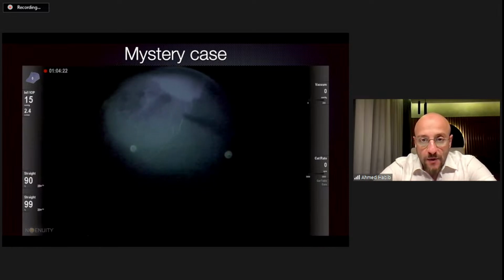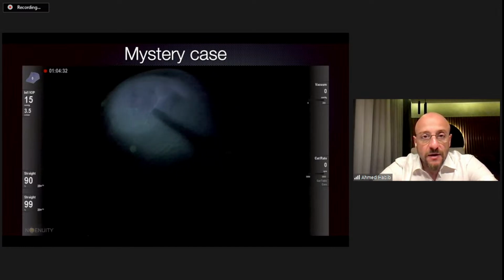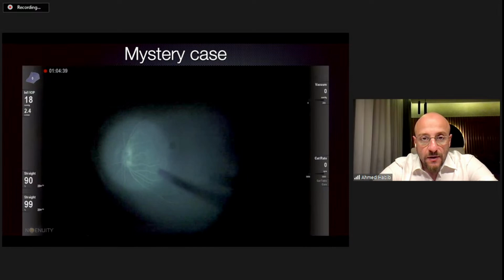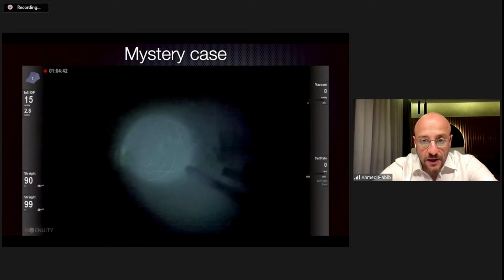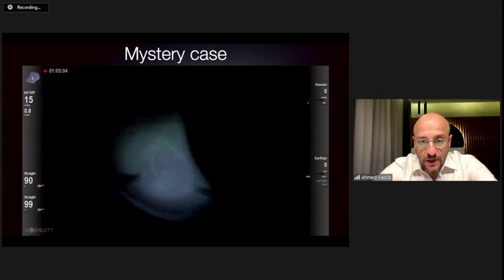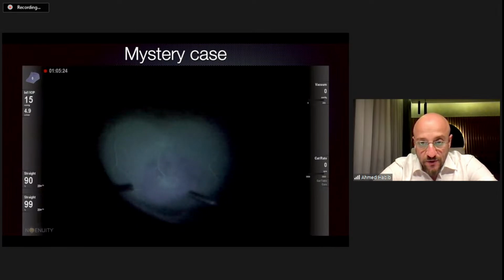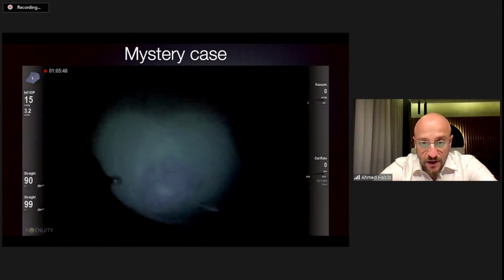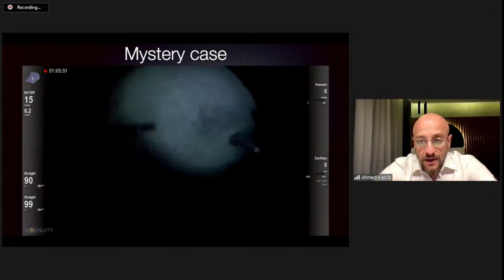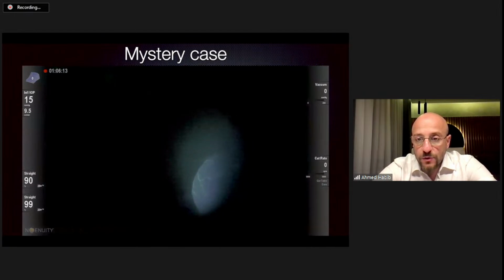We were thinking about the cause, and so we waited for the late phase. Here I'm just checking the areas where the vasculature stops, and as you can see, there is leakage in the macula and leakage on the disc, and here coming for the late phase. And as you can see, if I want to see something better, I approximate the light and the fluorescein, and the fluorescence is visualized better. And here you can see the area where the anastomosis is leaking, and maybe this is the cause of the hemorrhage as well.